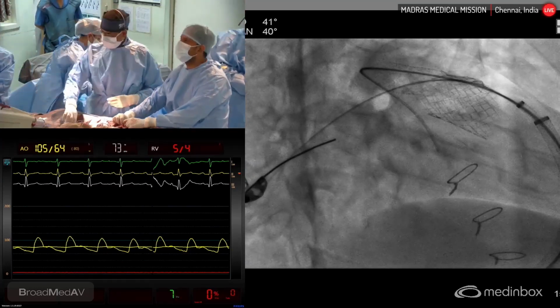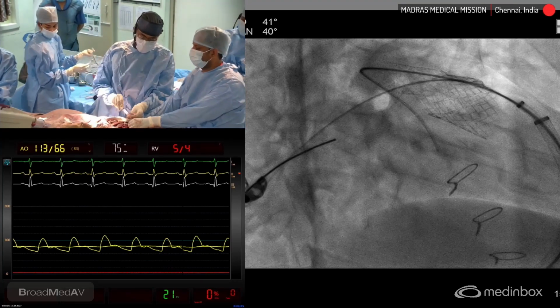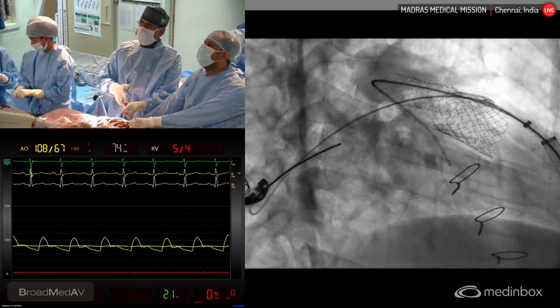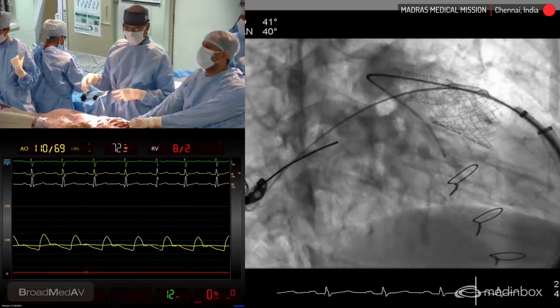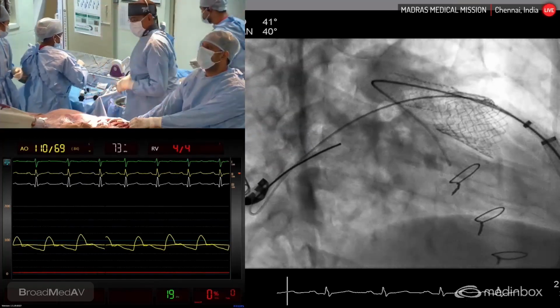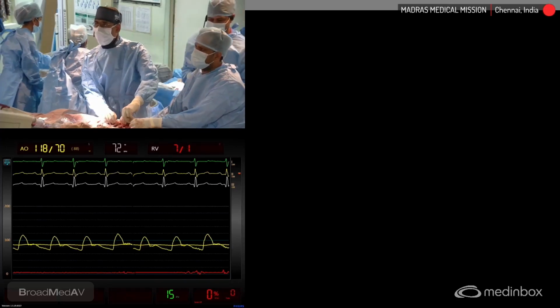So the formula stent has now come out. I'm making another angiogram through the side arm of this sheath. So that is the left pulmonary artery. Now we need to go into the right pulmonary artery. So what we'll do is, there was a sheath that we prepared already, the 7 French sheath. Now this one, I'm going to take it out. You're controlling the Lunderquist wire.